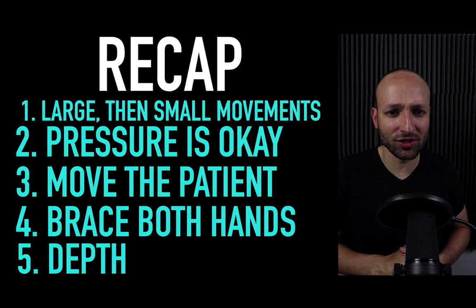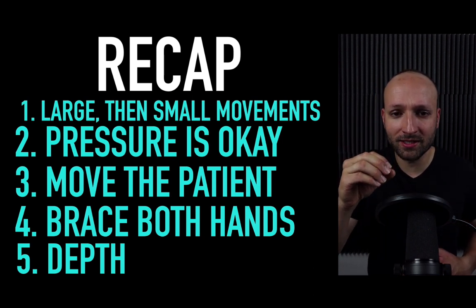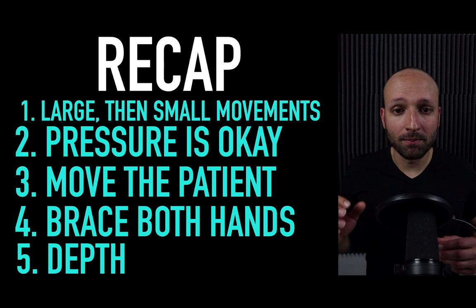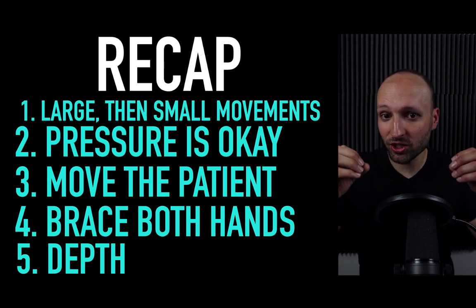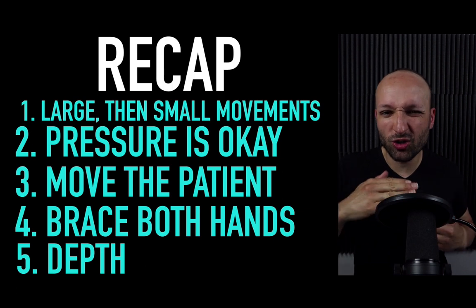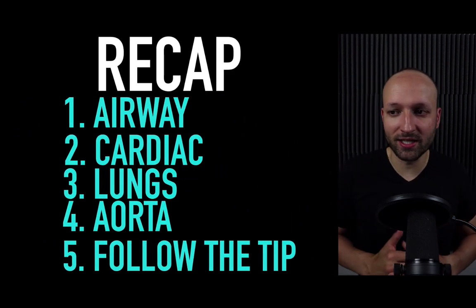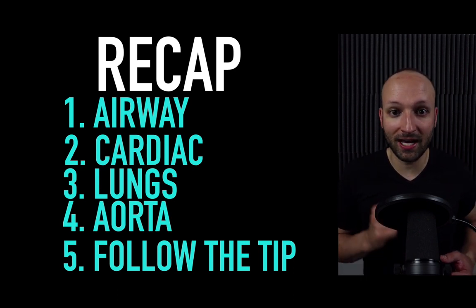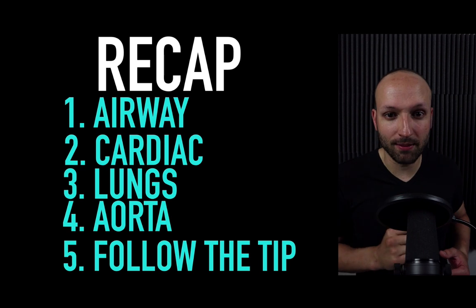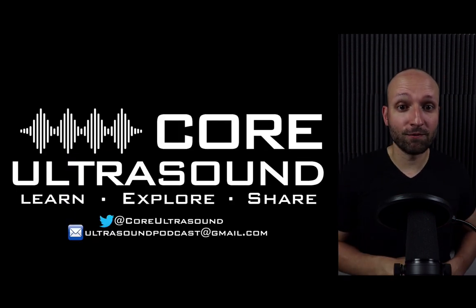For our second section, this is regards to technique. Remember, large movements, then small movements. Pressure is okay. You can move the patient around. They're not fixed. Brace your hands, especially if you're doing procedures, and then make sure that you have adequate depth. And as far as techniques, we just went through this section. We got some airway tips, cardiac tips, lung tips, aorta tips, and follow the tip when you're doing any kind of ultrasound guided procedure.